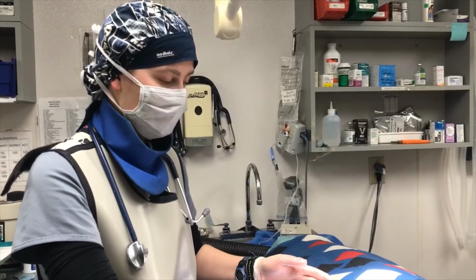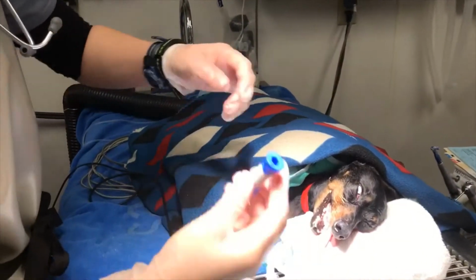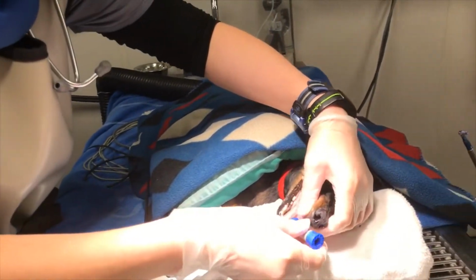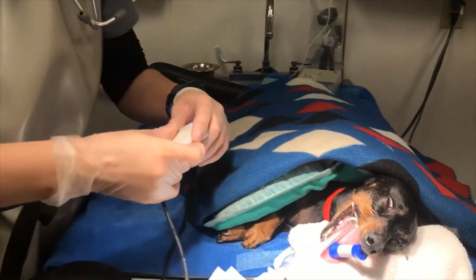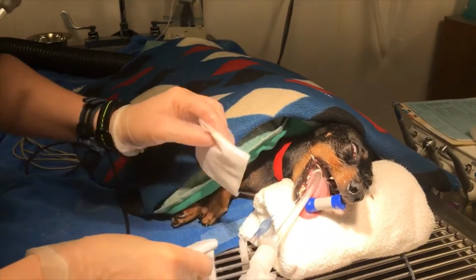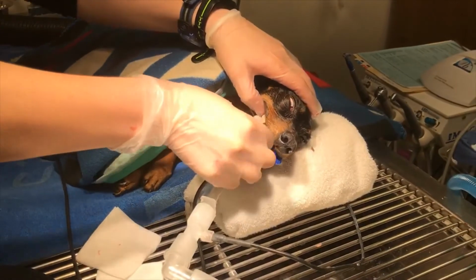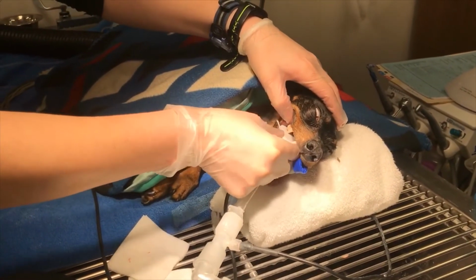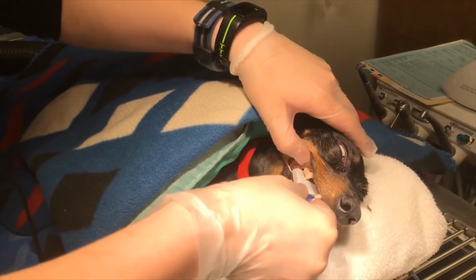We are going to X-ray Gemma's teeth. An important thing to note is you want to have a mouth gag to keep the mouth open, as you don't want them biting down on the plate should they start to get a little bit light. That just helps protect the very expensive plate. For this one, we'll do a bisecting angle for the upper right arcade.